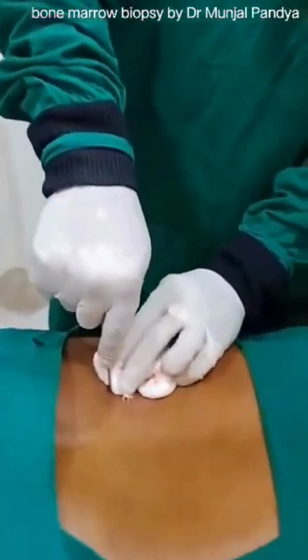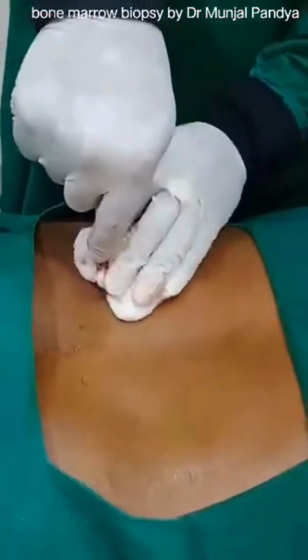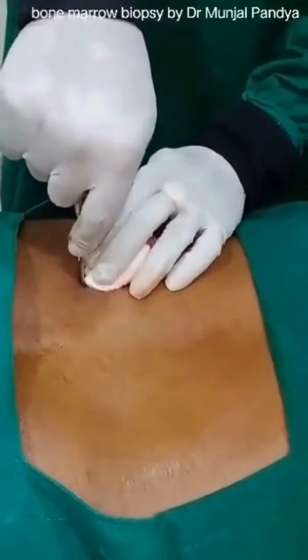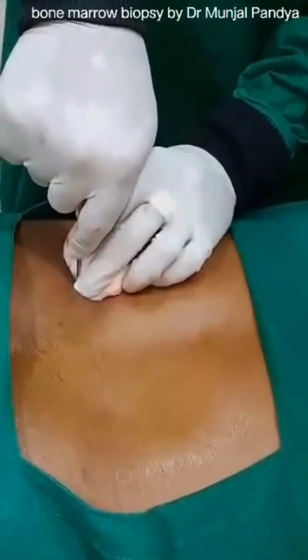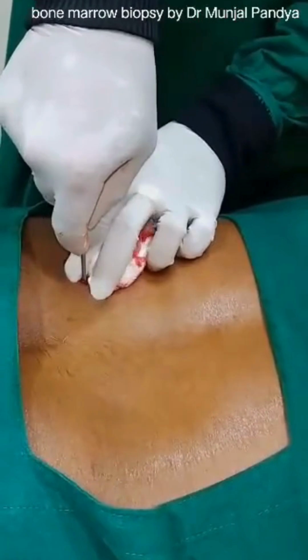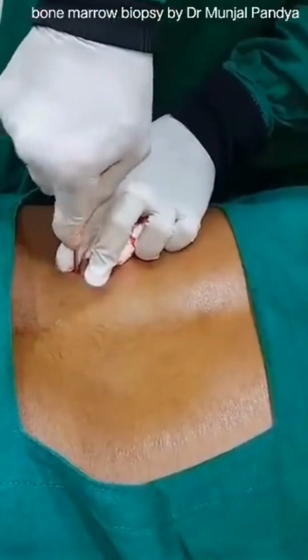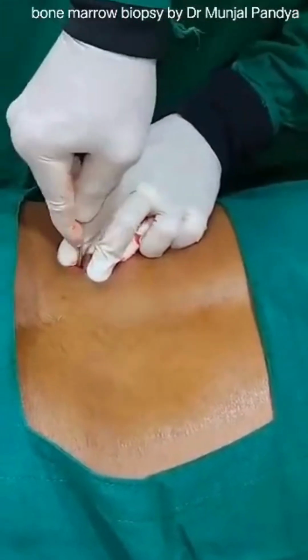It's a little difficult, but you must take a trephine sample in most patients, because aspirate will give you an idea about the morphology of the blood cells, like red cell, white cell, platelet and marrow cells. But when you want to know the cellularity, when you want to know the infiltration in the bone marrow, like leukemic or lymphomatous involvement or some metastatic lesion, you have some stains and IHC on this bone marrow trephine. So the initial procedure would be the same as aspirate, but wherever it changes, I will give the commentary.